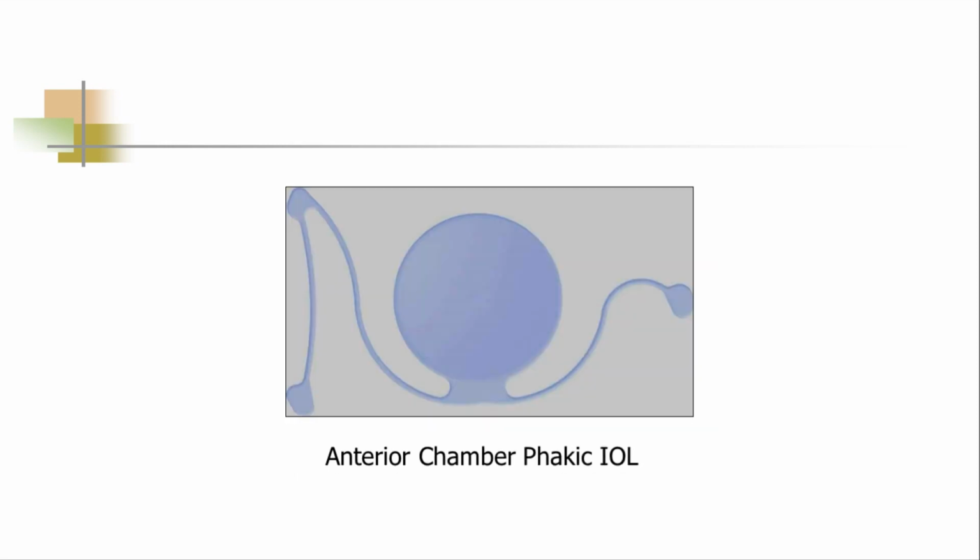This IOL is an anterior chamber phakic IOL. It is again neither much used nor very popular because of its safety concerns like all other anterior chamber implants. Bullous keratopathy is again one of the most major complications that could occur.